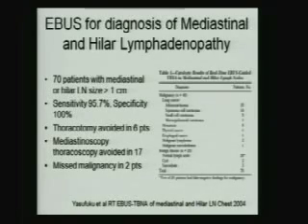They were able to diagnose lung cancer, multiple other metastases, thyroid cancer, esophageal cancer, lymphoma, and even mesothelioma. And they had 20 patients here with benign diseases, of whom 2 were missed malignancy, which translated into this less than perfect sensitivity. They were able to avert thoracotomy in 6 patients and mediastinoscopy and thoracoscopy in 17.